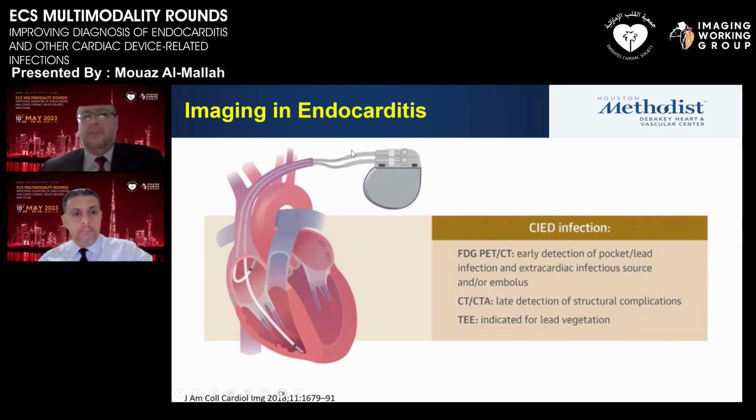For devices, FDG PET is going to be your main tool to look for local infection. CT may add, but we always get some sort of CT with PET CT, and the leads also are going to be, it will be very helpful to assess them with FDG PET.